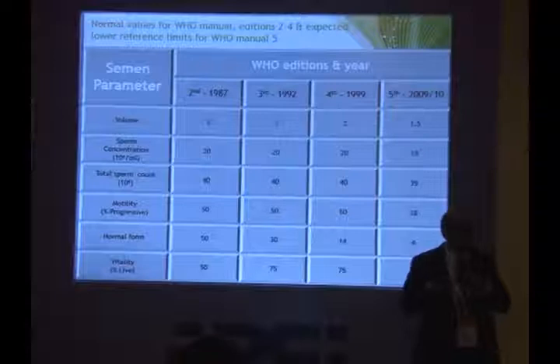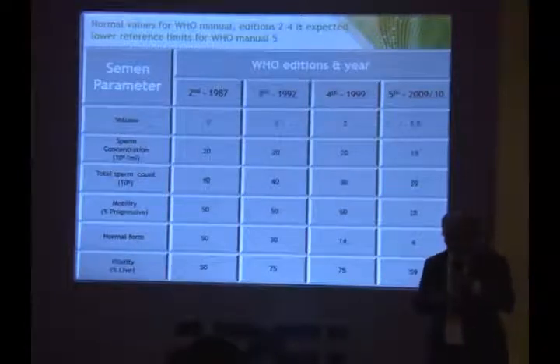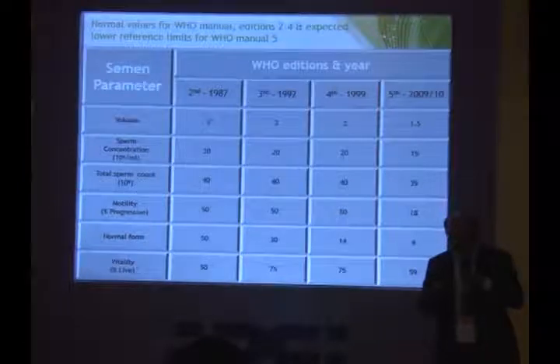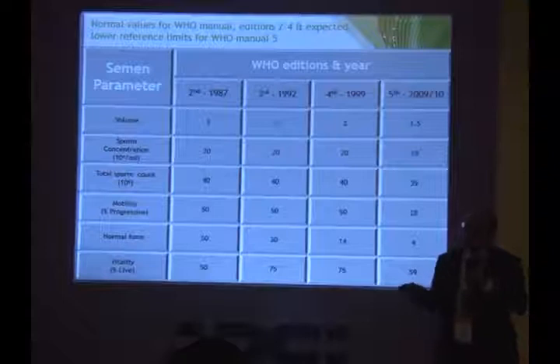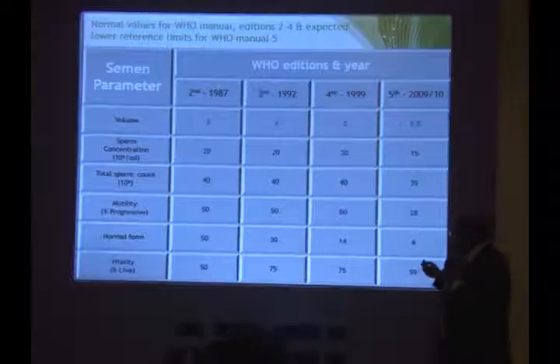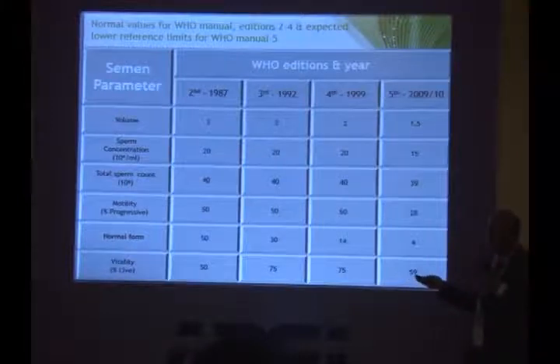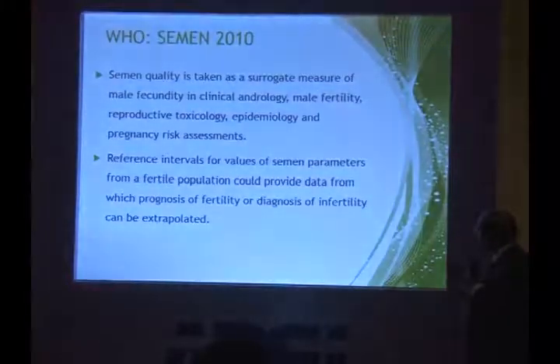So this all indicates polarized sperms in the mitochondrial membrane potential test. In HOS, the functional integrity of the sperm membrane is judged, and only the viable sperms would show HOS positivity, or the eosin-nigrosin stain, which we will be seeing. But why I am telling you this: as you will see, the main change has occurred in the normal morphology scores. So that's why it's important to understand morphology very well.